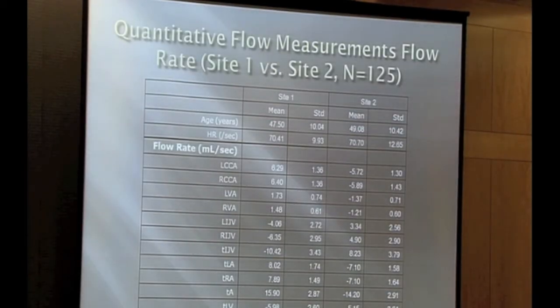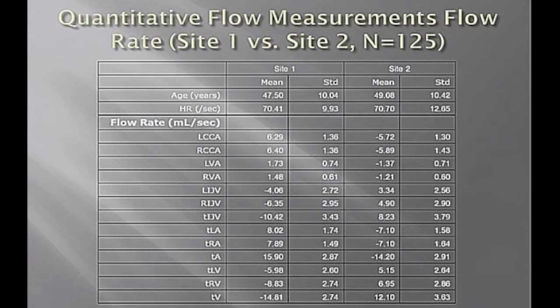So I'm just going to show you one or two tables here, and I'm not going to go over every example, but I want to show you that sometimes in different sites using different flow quantifications, using GE versus Siemens, for example, depending on the cardiac gating you do, whether you use pulse triggering or cardiac gating, you might be wrong by 10%, or I might be wrong by 10%, or let's just say we're different by 10%.